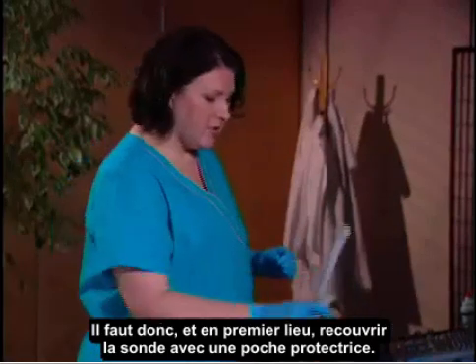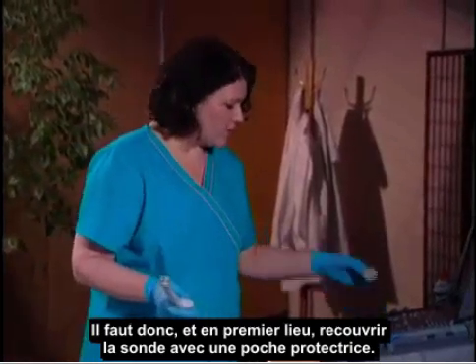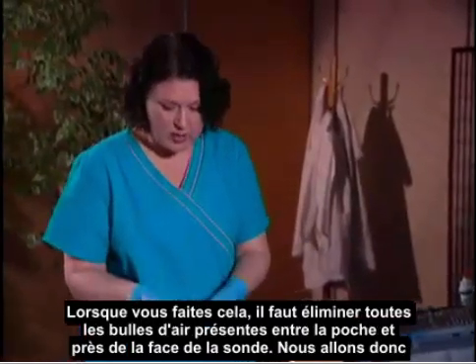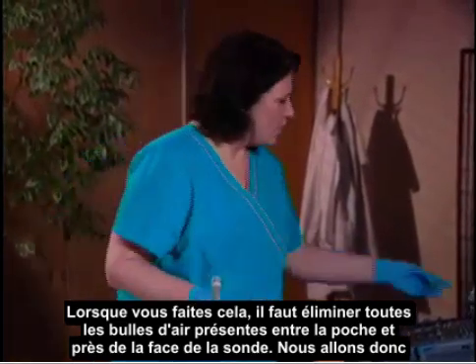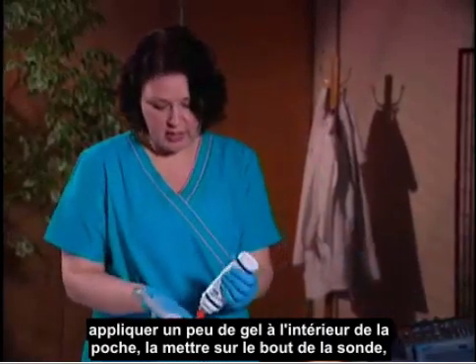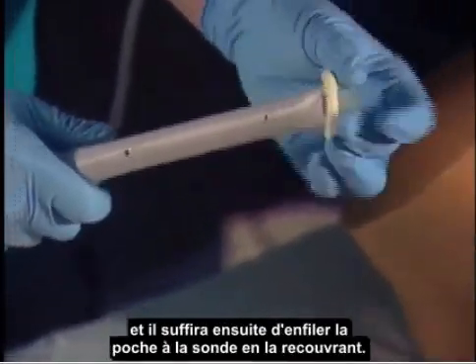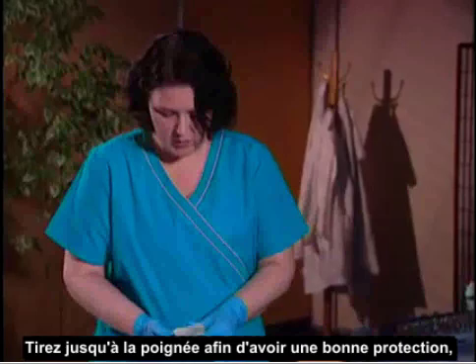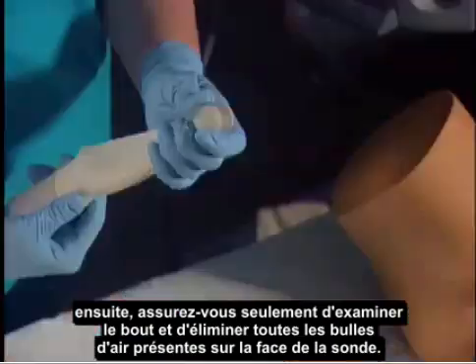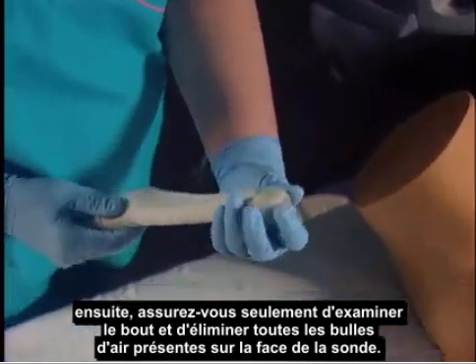The first stage of prep for the intercavitary transducer is to cover it with a sheath. We need to remove any air gaps inside the sheath next to the transducer face. Put a little bit of gel inside the cover, position it over the tip of the transducer, then pull the covering down over the transducer and handle for good coverage. Examine the tip and eliminate any air bubbles covering the transducer face.